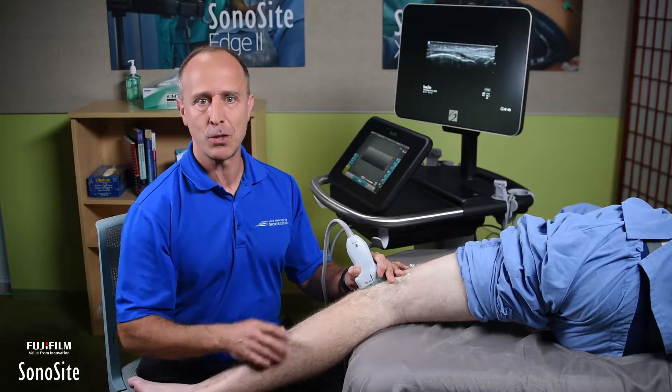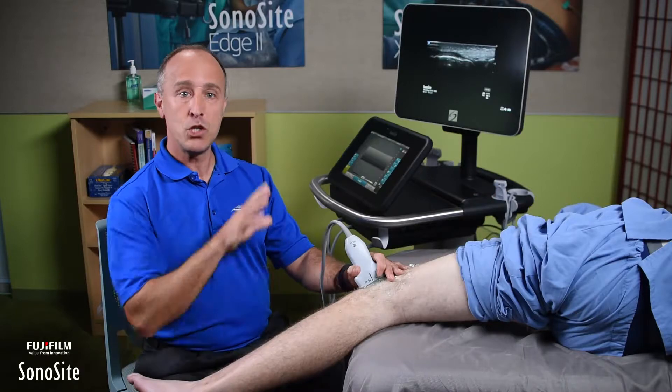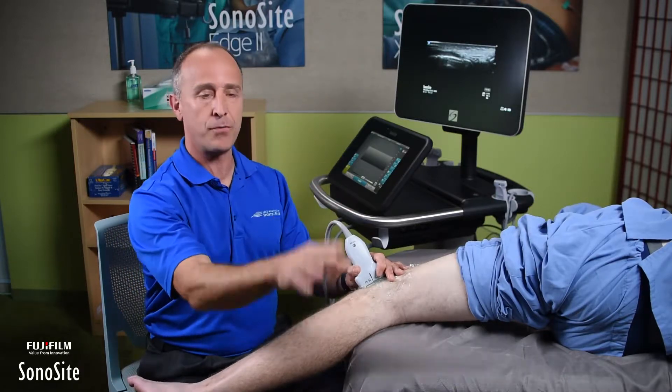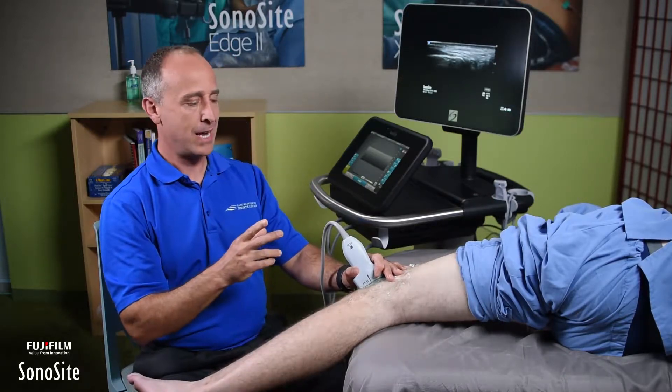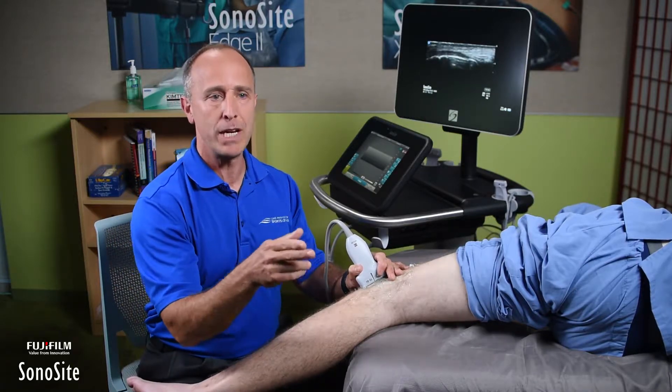Because if you're watching right now, you'll notice that the machine is behind me — that would be incorrect. The machine would normally be right in front of me. I want to have the probe, the patient, the machine, and the screen all in my field of view.